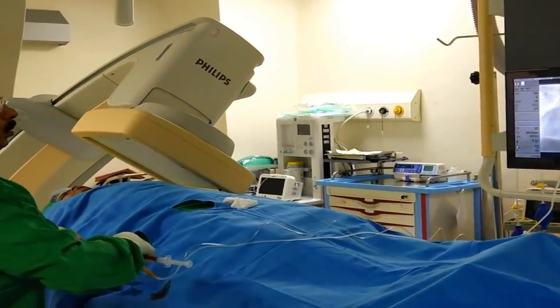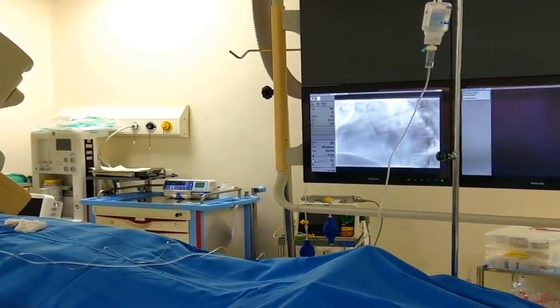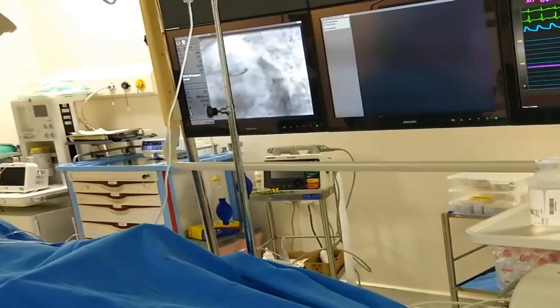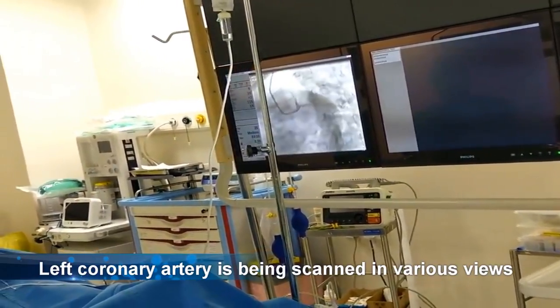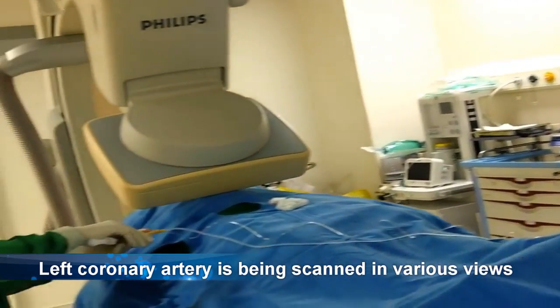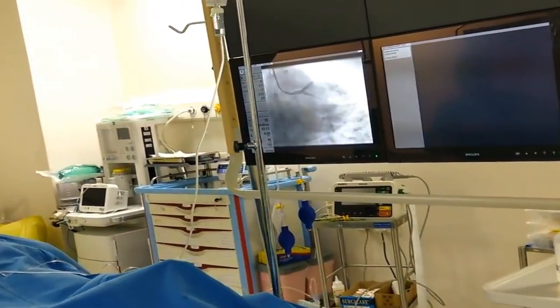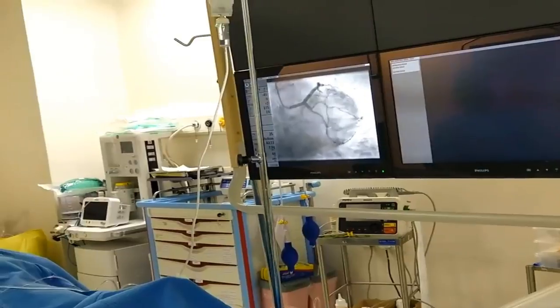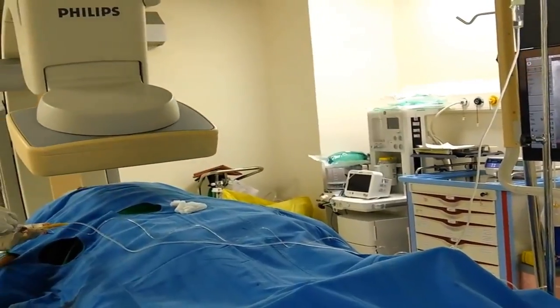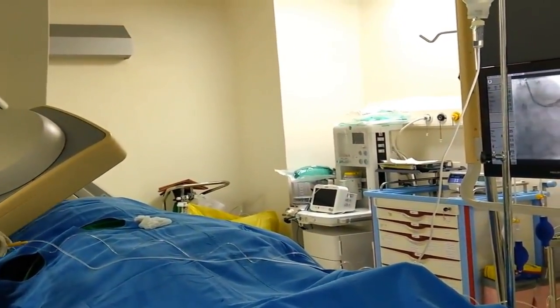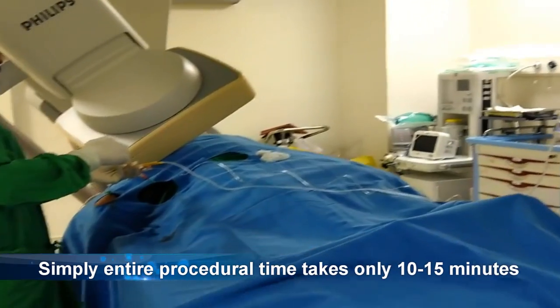In order to get a complete view of the right coronary artery, the X-ray tube moves in different directions and angles to diagnose the coronary artery at all levels. Now the left coronary artery angiography is being done, also in different angles and positions to get the best result. By seeing the anatomy, sometimes we need extra angles and special views to see junctions, lateral vessels, and angular vessels.